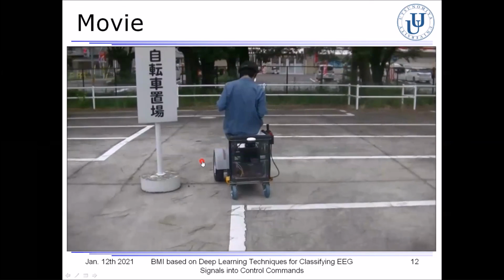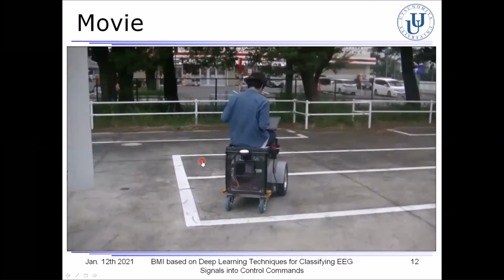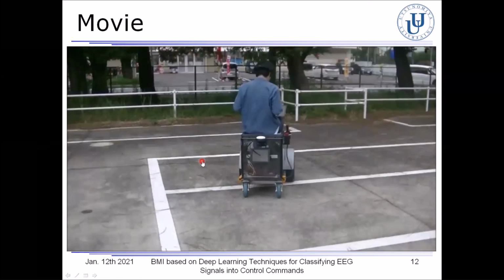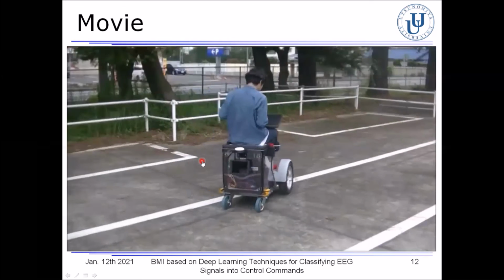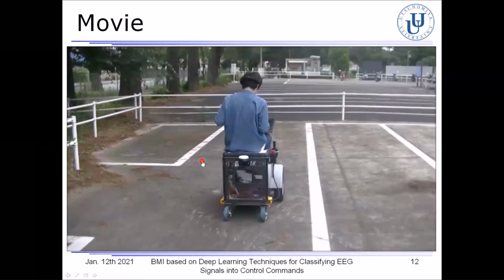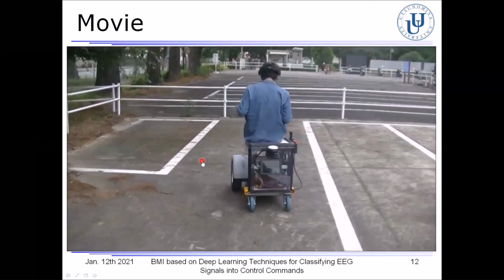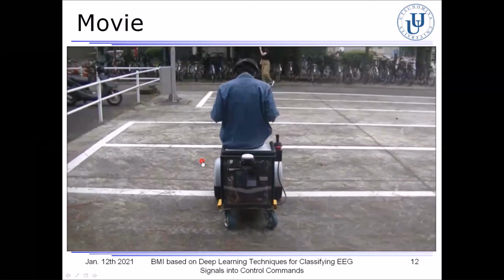In this experiment, the classification performance of the BMI was 100% in the clockwise direction and 99% in the counterclockwise direction, respectively. So the results showed that the BMI performance was enough for the user to control the PMR as intended with only the mental commands.